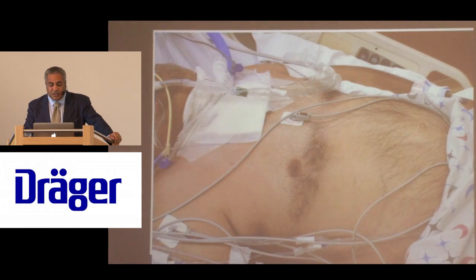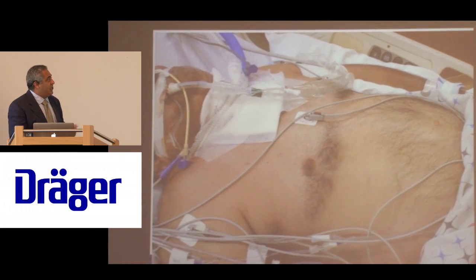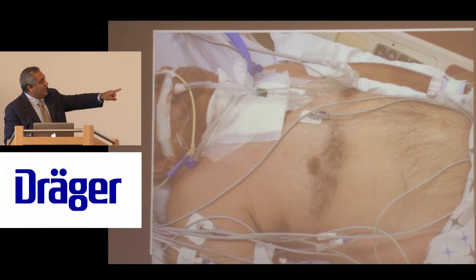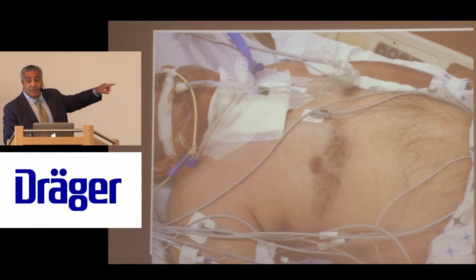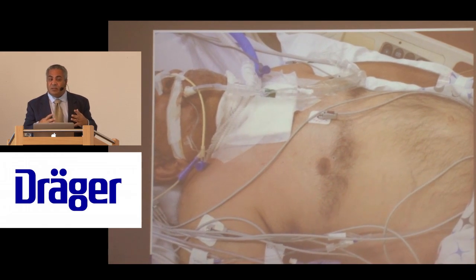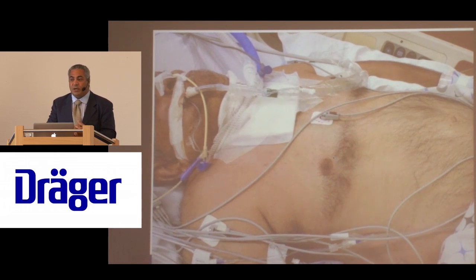It's much easier to see in person, so I usually show a couple of videos just in case. But again, you can see he's going to squeeze with his belly. This is active exhalation. And then you can see, I think, the bounce that he has when he lets go, when he relaxes. And so this is, for us, a way to adjust the pressure.